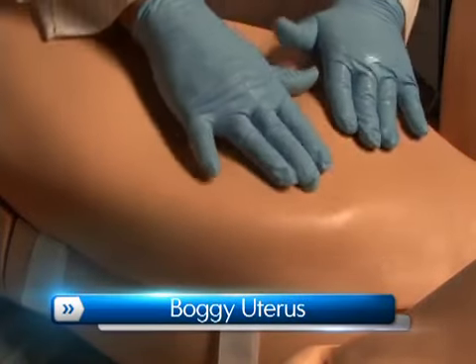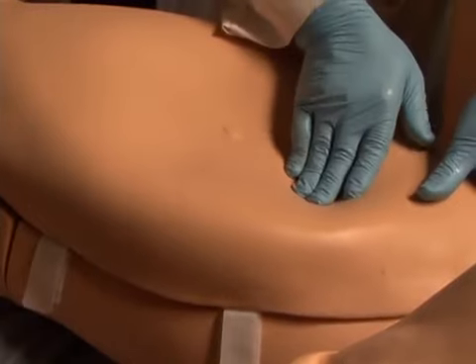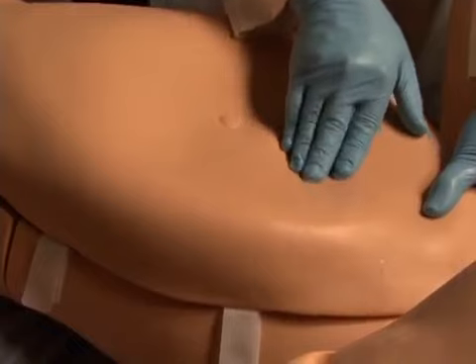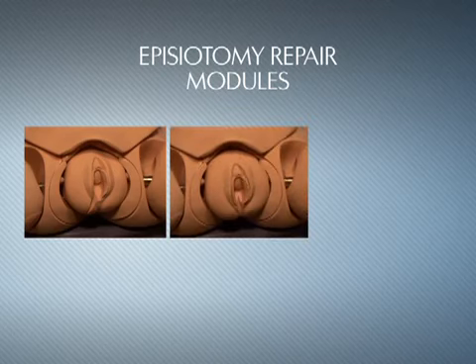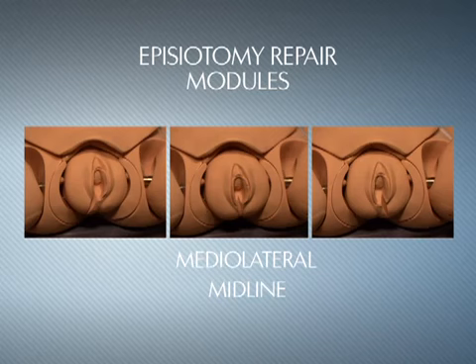Other scenarios might lead to a boggy uterus that can be assessed through abdominal palpation. It can subsequently be relieved through fundal massage. For additional training purposes, the providers can practice suturing any of the 3 episiotomy repair modules. 2 medial lateral and 1 midline episiotomies are included with NOELLE 575.